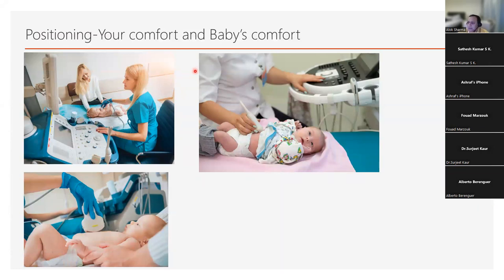So let's make this a little bit interactive. We've talked about this image over here. So what is it that we can do in this particular situation to optimize and help? Anybody? So you can see my cursor. Swaddle. Sorry? Swaddle. Okay, so if you swaddle this baby with, say, a cloth or the nursing kind of, how are you going to do your scans? So we can hold the baby, baby's arms, some assistant can hold. Yep.